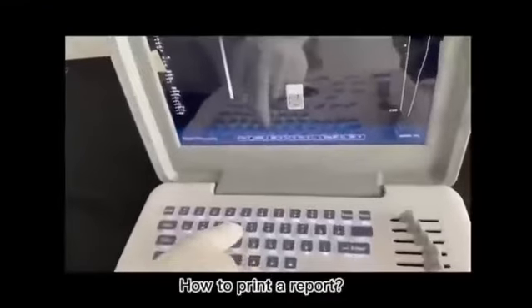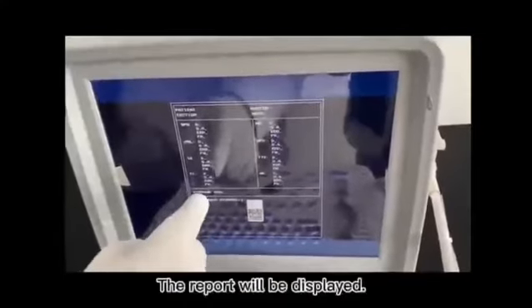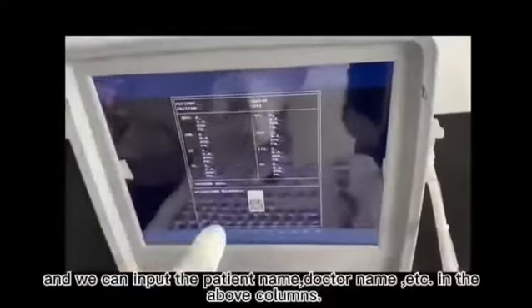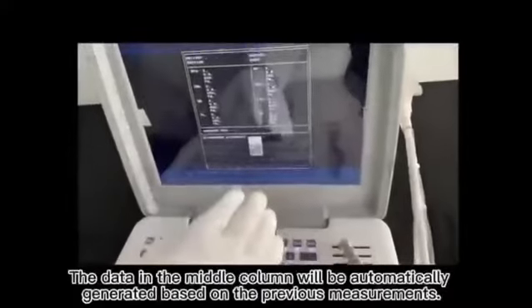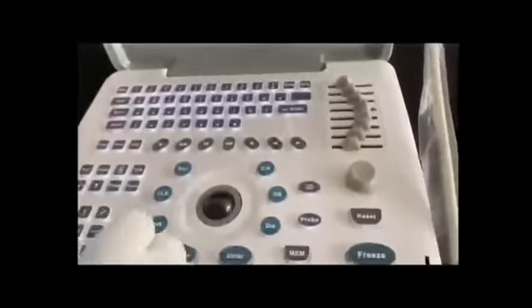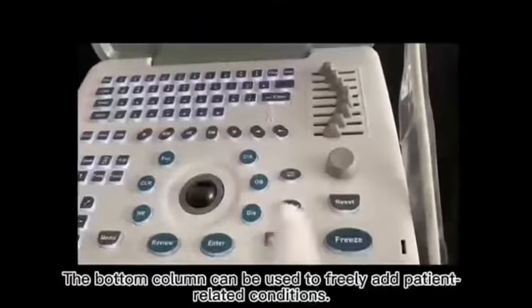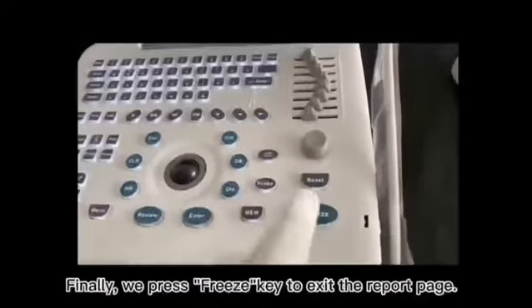How to print a report? Press the R key in the frozen state. The report will be displayed. And we can input the patient name, doctor name, etc. in the above columns. The data in the middle column will be automatically generated based on the previous measurements. The bottom column can be used to freely add patient-related conditions. Finally, we press the Freeze key to exit the report page.